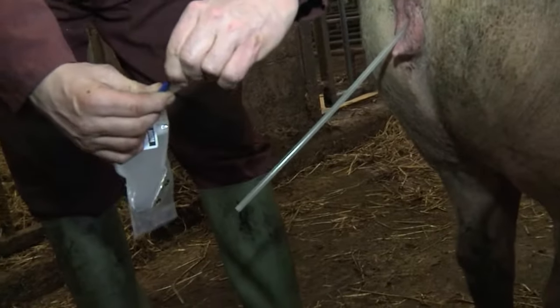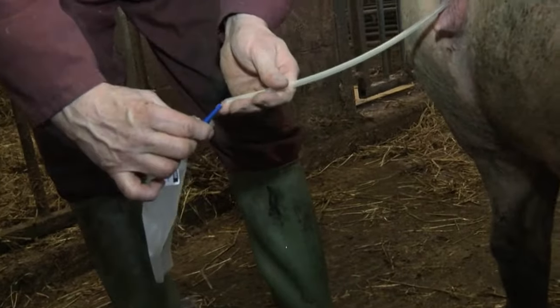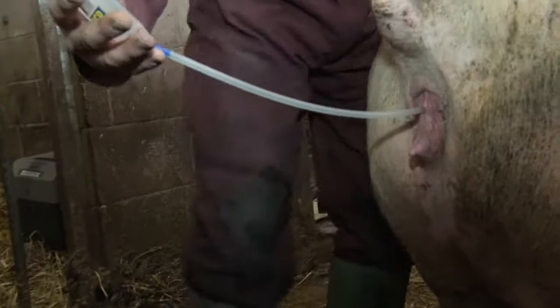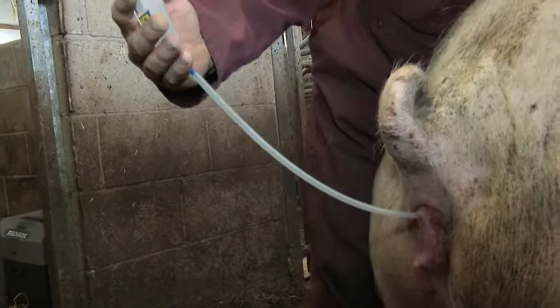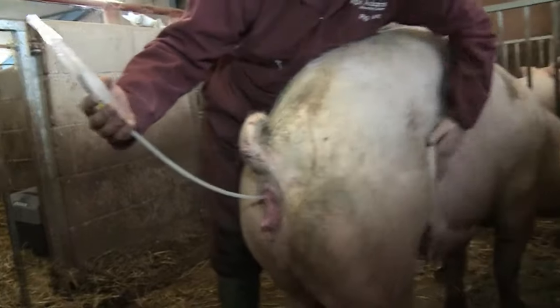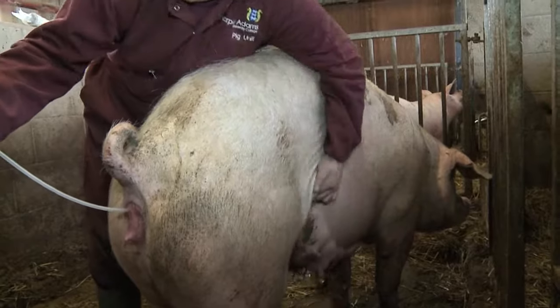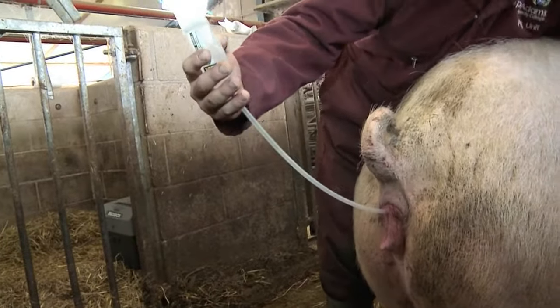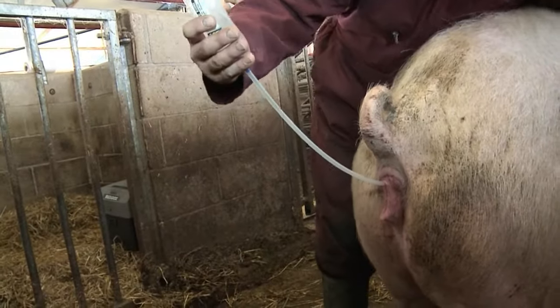Ensuring your hands are clean, remove the top of the AI dose and attach to the stem of the catheter. You can continue with back pressure and rub her flank and underline. Allow the AI to be drawn in by the sow. Don't be tempted to squeeze the AI dose and force the AI in.